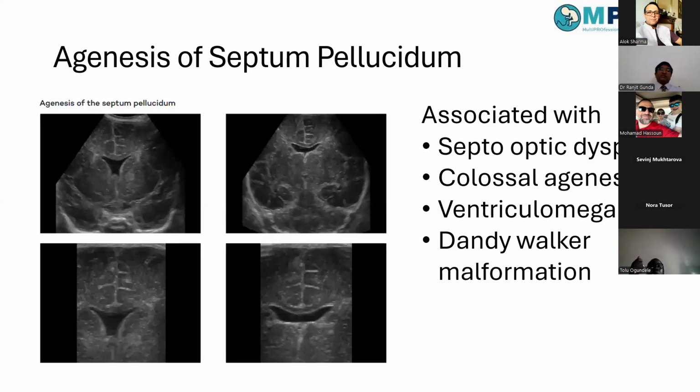One of the common things hydrocephalus is associated with is absence of the septum pellucidum or cavum septum pellucidum. You can see here in the midline view, there is no separation between the left and right ventricles. It all looks like one big ventricle connecting both, and sometimes looks like a butterfly. There's a flattening of the upper part of the ventricles. So in various views, if you see a communicating continuation of ventricles between the two cerebral hemispheres, we should suspect absence of the septum pellucidum.